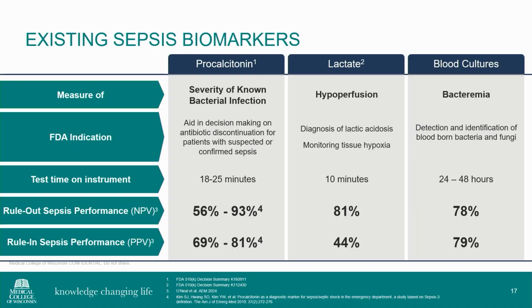And then we have the blood culture. It's a test to measure bacteremia. It allows us to initiate definitive therapy, but the turnaround is pretty bad on it, 24 to 48 hours. And the rule out for sepsis after that 48 hours, or in many cases a 5-day incubation, is around 78%. So there's some opportunity for improvement there.